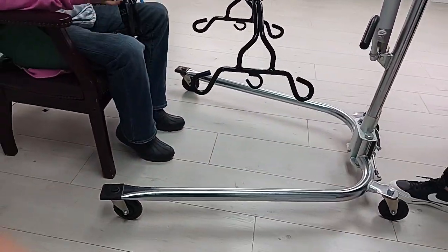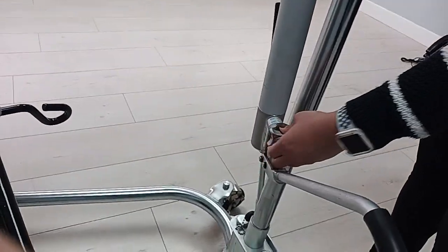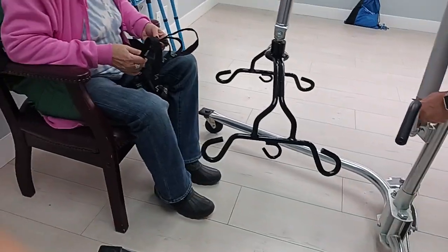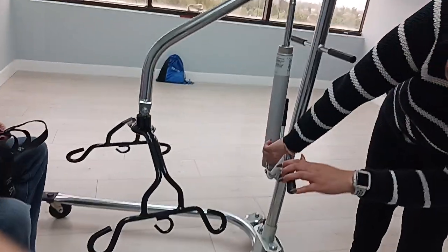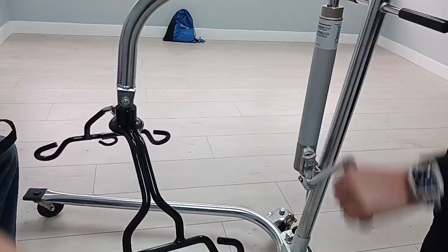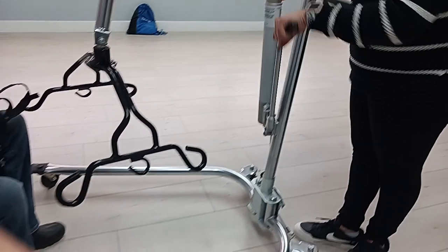Okay, so here it is. We've got to make sure this is all the way to the right. It's an air piston and it just bumps up and bumps down, just like an engine — like an engine hoist. Yeah, I've used one of those. We're lifting it so that we can hook it on.